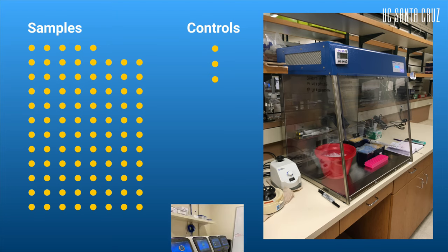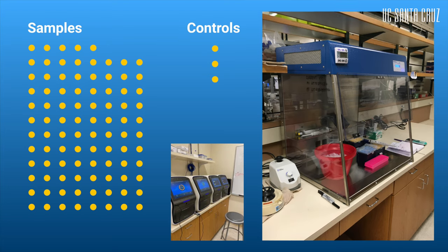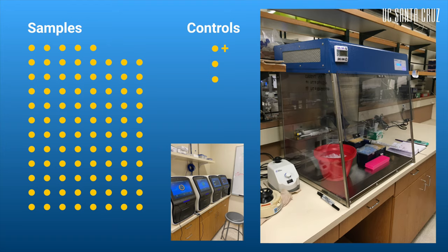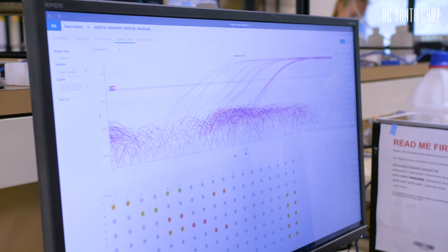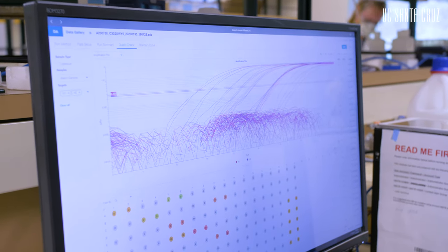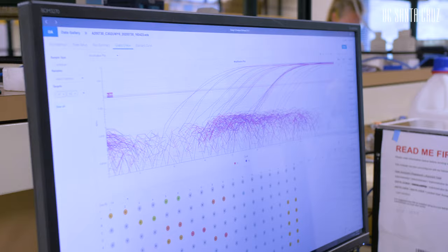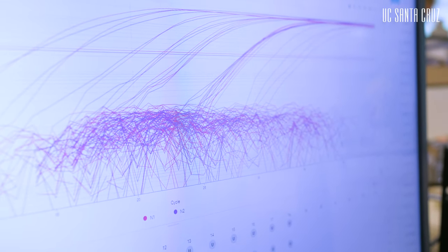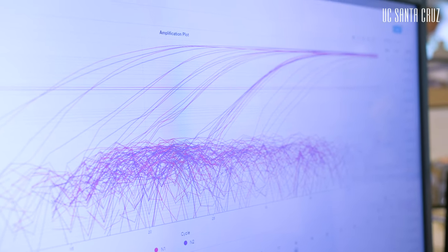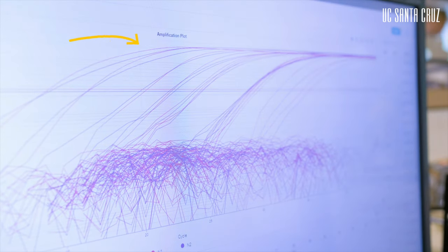Once those samples are run on a thermocycler, the data is outputted. We load a positive control to ensure that the reagents are working as planned and we can detect the virus. Whether a sample reaches that threshold or is below that threshold determines whether the patient is positive. In this image showing data output, there are three wells highlighted depicting one particular sample. RP is the internal control that tells us that we've collected enough material. N1 and N2, which are the purple and fuchsia colors, measure the presence of the virus. N1 and N2 are amplified in the sample, indicating that the patient has COVID.